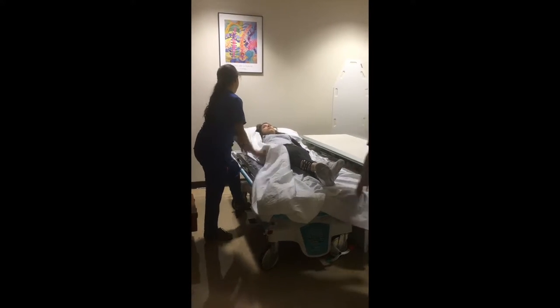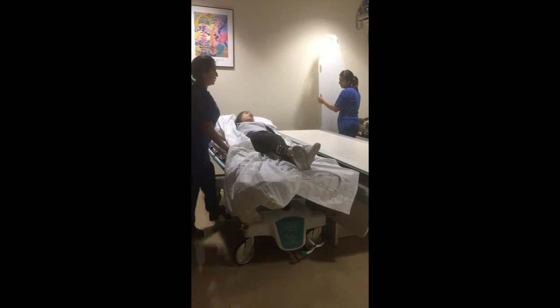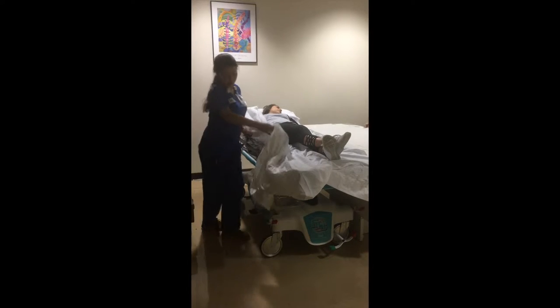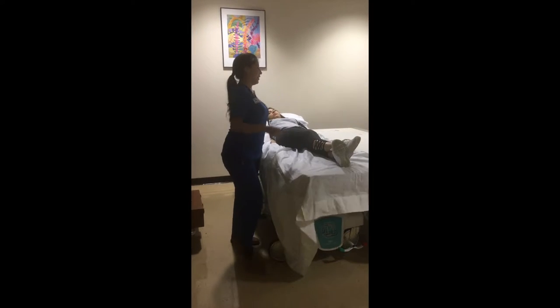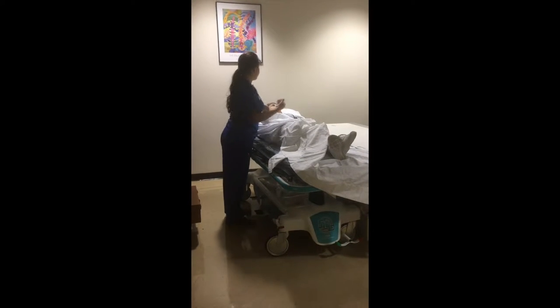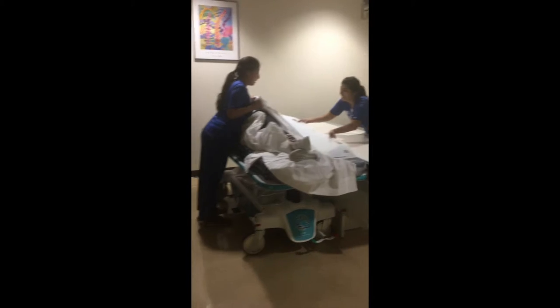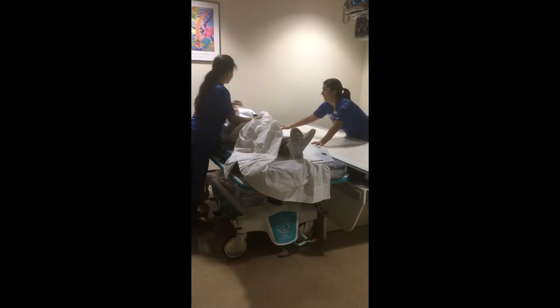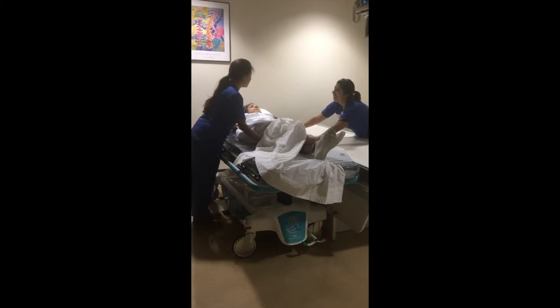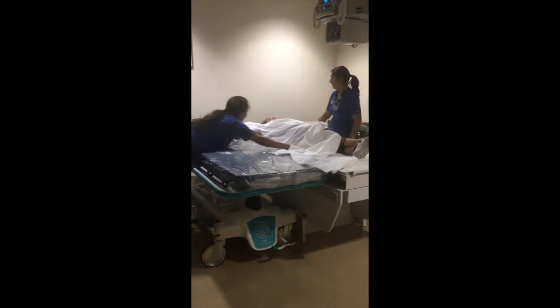Ms. Morgan, we're going to transfer you onto the x-ray table. We're going to lift you up — I'm trying to do this as carefully as possible. Put on your brakes — always put your brakes. I'm going to roll you towards me; Sarah's going to put the backboard behind you. It might hurt a little bit, I'm so sorry. On three, we're going to transfer you. One, two, three.